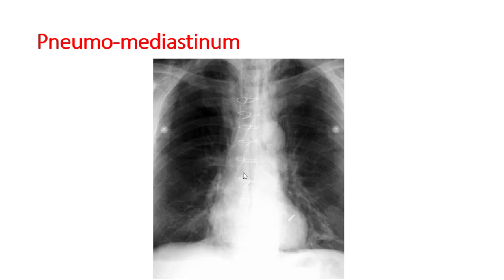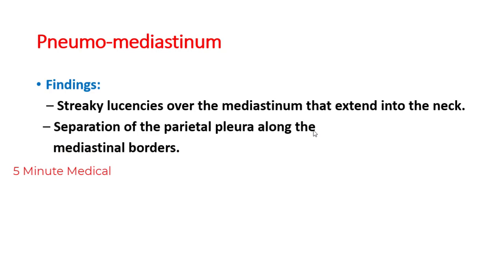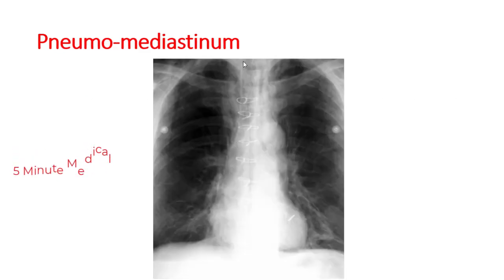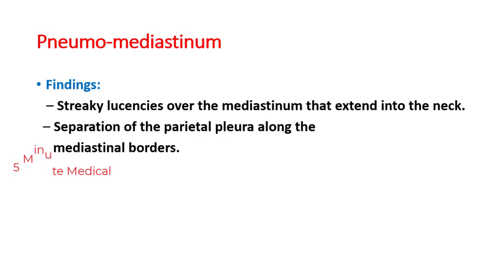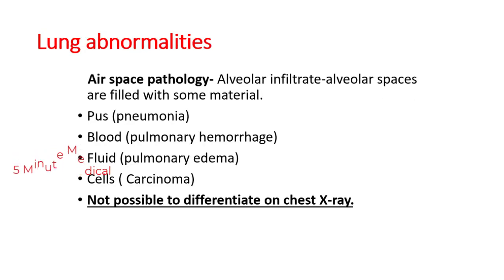Pneumomediastinum may be caused by CABG — coronary artery bypass graft surgery — where air enters the mediastinum. Key findings include streaky lucencies over the mediastinum extending into the neck and separation of the parietal pleura along the mediastinal border.